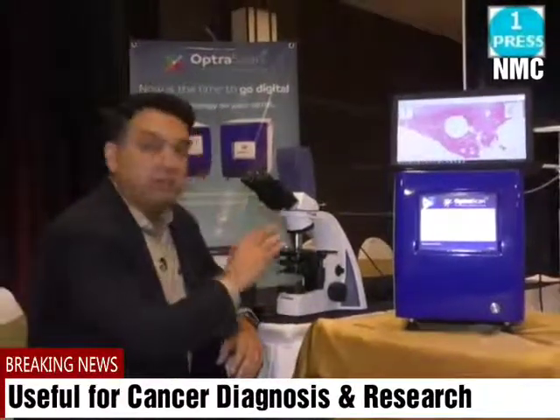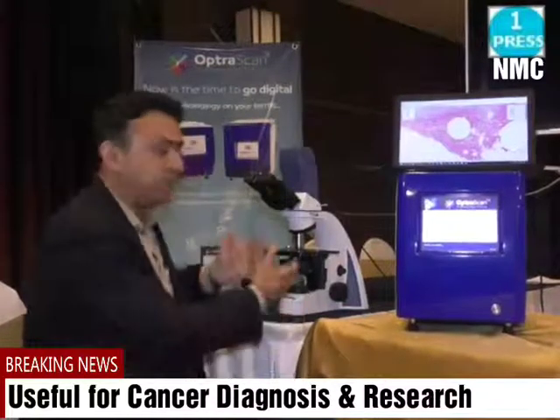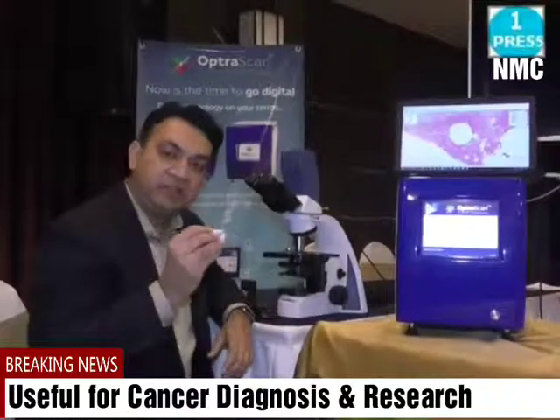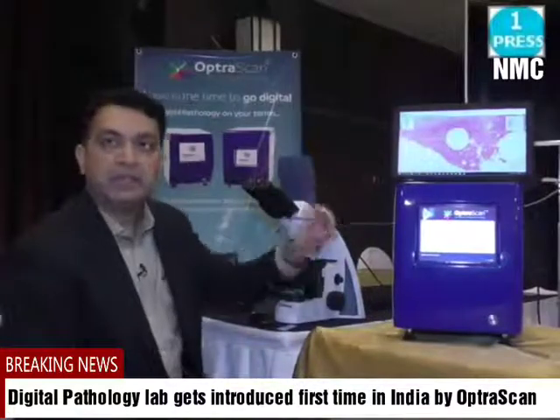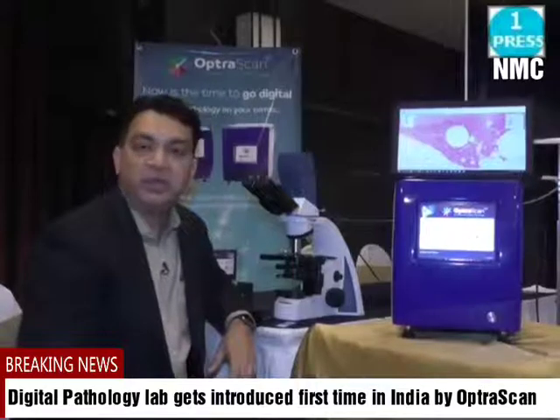Also, the data can be shipped across the network very quickly. What does that mean? If you are using a microscope and I had to take a second opinion, then I had to create one more slide like this and send it through courier to my expert. But now, since it is in image format, at the click of a button, I can send this data to any of the pathologists very quickly.